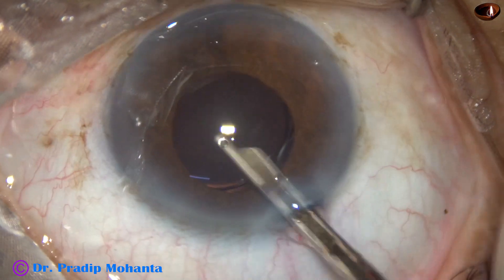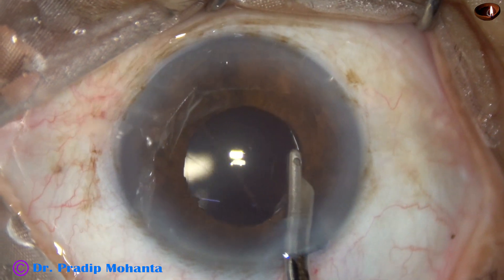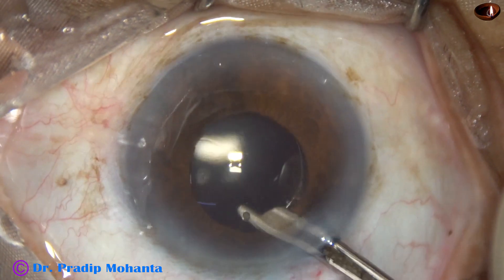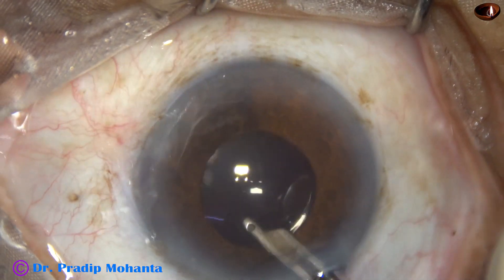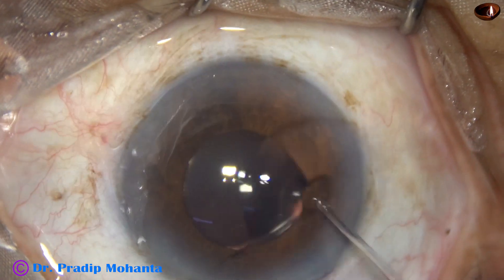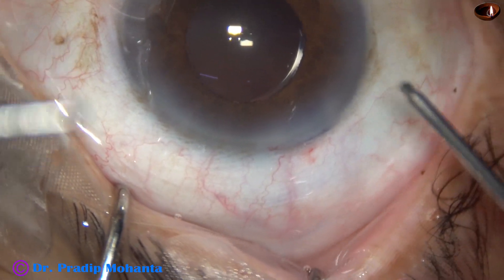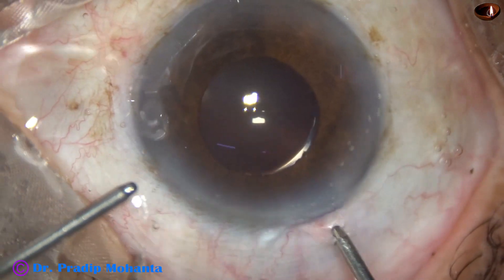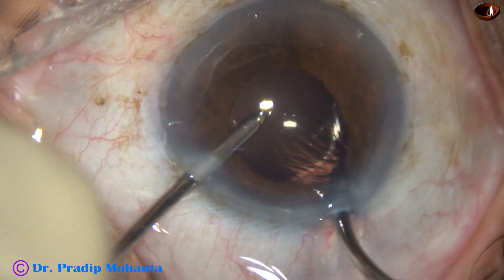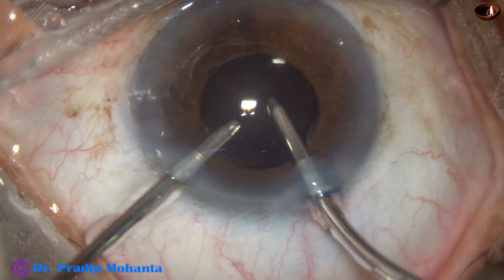Unless we do a nice cleaning of the viscoelastic, the intraocular pressure will rise. There will be steamy corneal edema. The patient will be very uncomfortable. The patient cannot see clearly the next day, and the patient doesn't feel happy. So we must clean all the visco very thoroughly. After using Simcoe for some time, I use the irrigation-aspiration probes. Irrigate the anterior chamber and then perform irrigation and aspiration together. And this is a nice cleaning of visco.